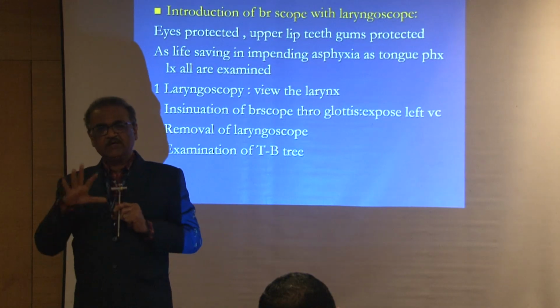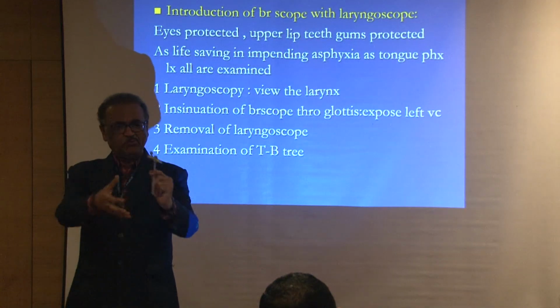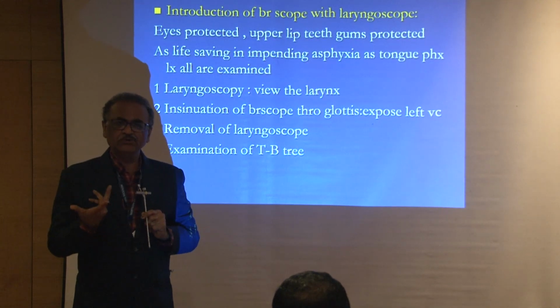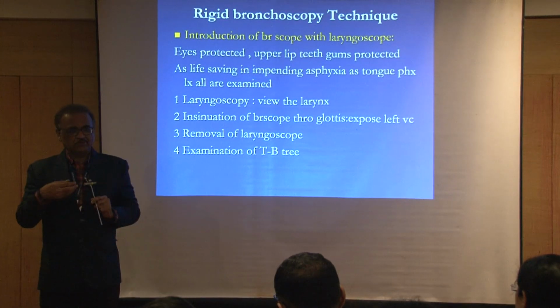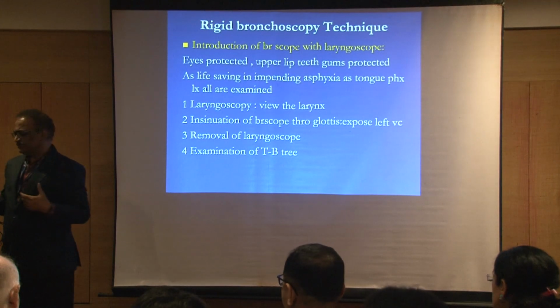Okay, so regarding the anesthesia, the best thing is never ever be in a hurry to remove it, because once you remove it you get no control over the airway. Now whatever we have talked about, we are just going to run through the slides in another few minutes and then any questions you have.